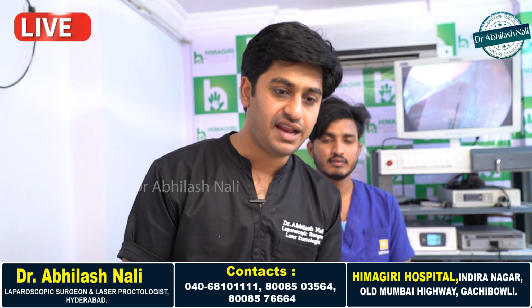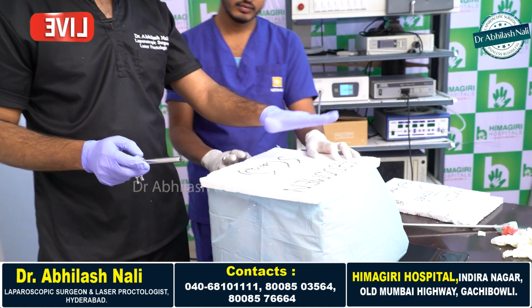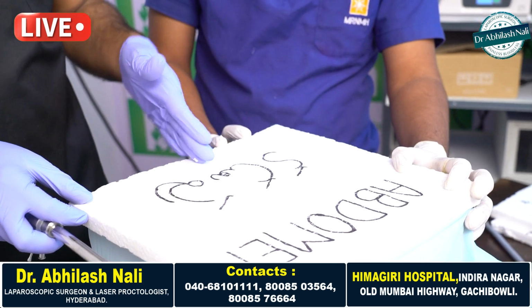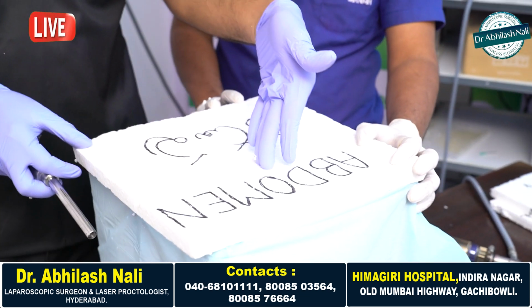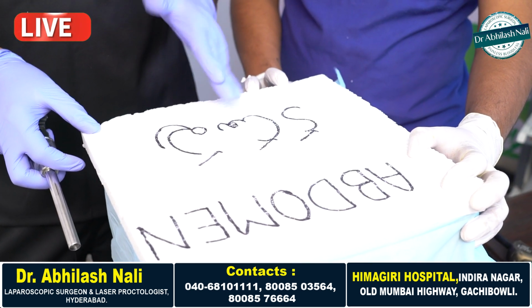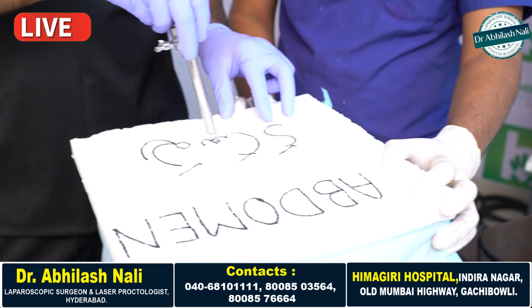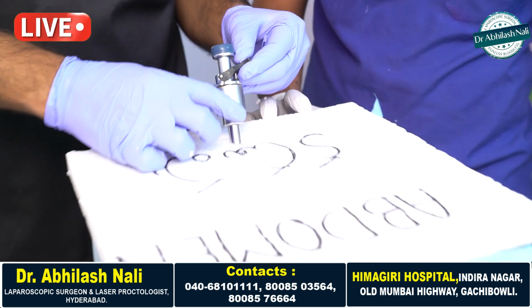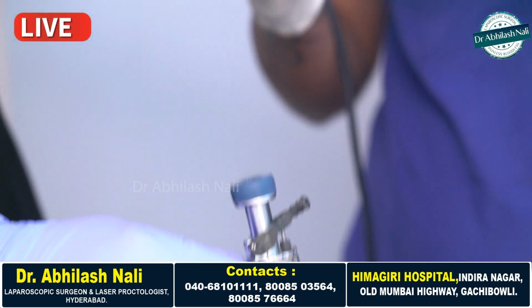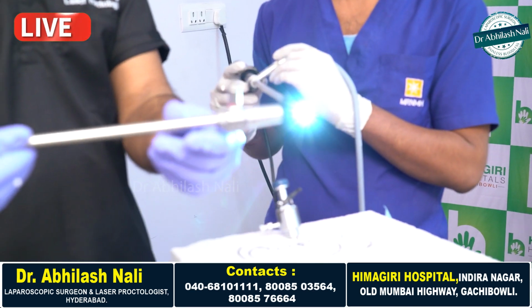But how exactly will a laparoscopic surgery be performed? Consider that this is the abdomen. In open surgery, we make a long incision to have access into the abdominal cavity. Whereas in laparoscopic surgery, instead of cutting open, through a 1 centimeter incision we'll be placing something called a trocar into the abdomen, and through this trocar we will be introducing the laparoscopic camera, and this is how a camera actually appears.